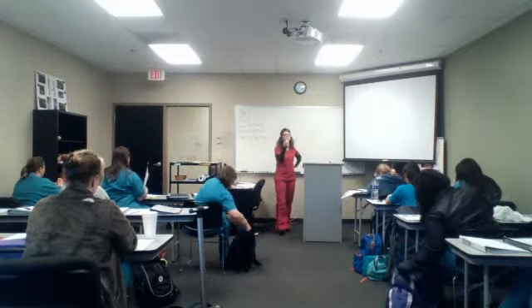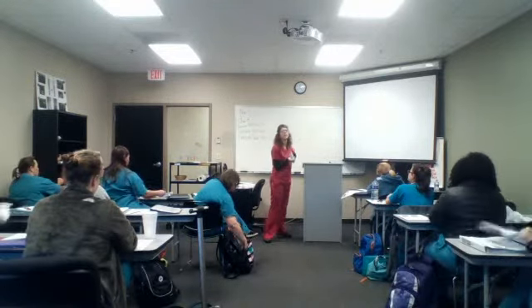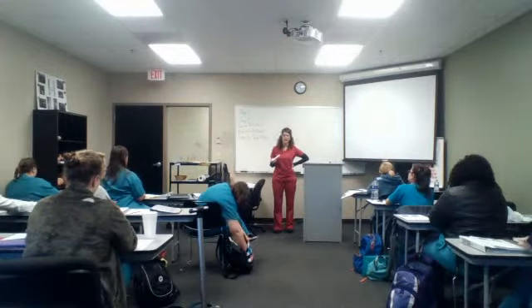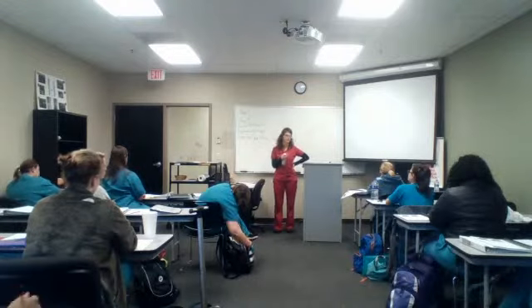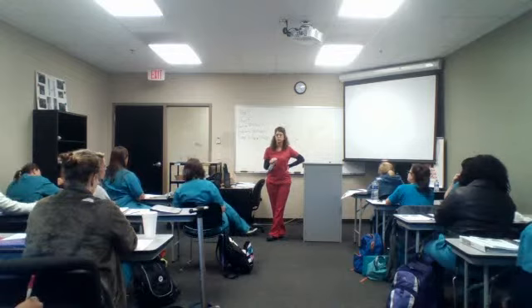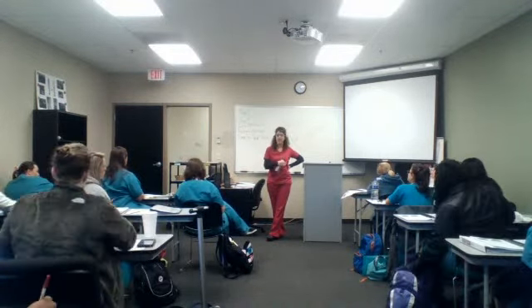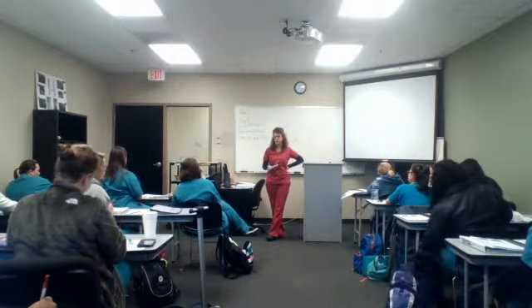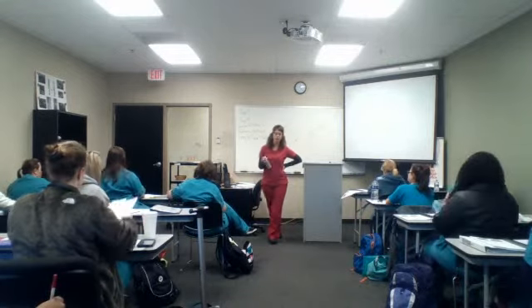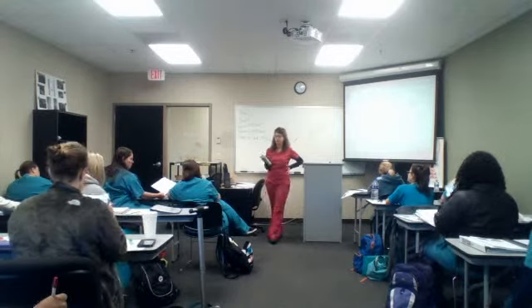I want to go ahead and tell you just a few more reasons why you may be called in to look at the leg for a venous study. If the patient needs to have a bypass graft in their leg, that means they've got a blockage in their artery, so most commonly they're going to use a vein to make a bypass around that artery. So a DVT, a bypass graft. Why veins? Because they use a vein to bypass the artery, and we're going to talk about what vein they can use and why they can use it.